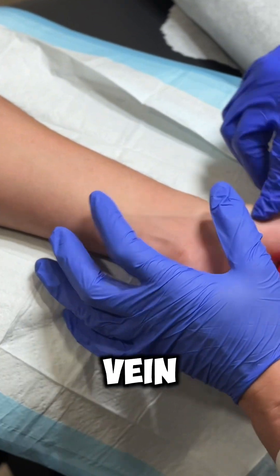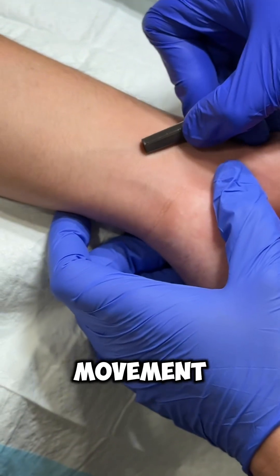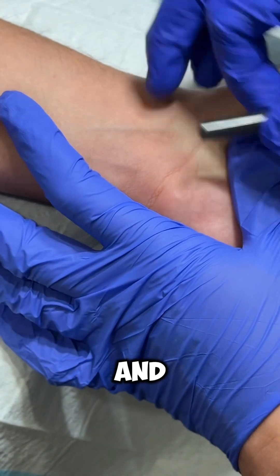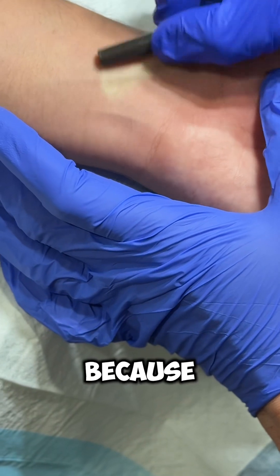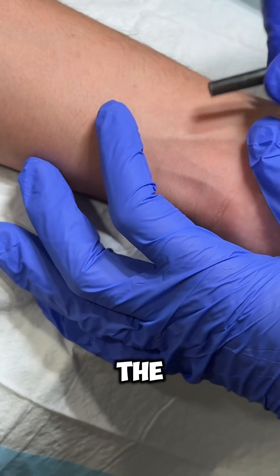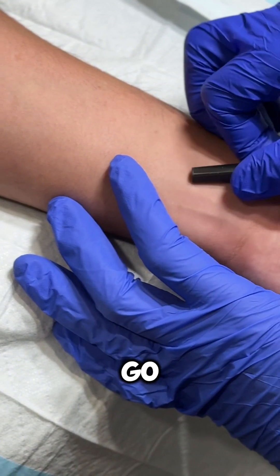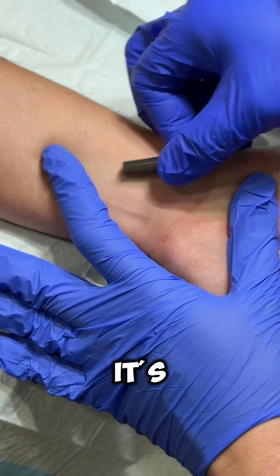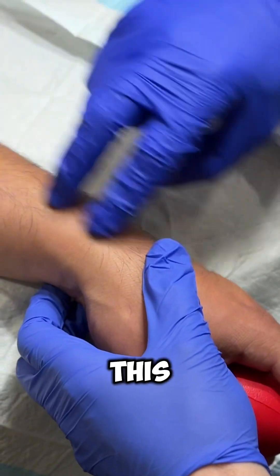This is a beautiful vein right here. The problem is, if you just go straight at it — see how it moves? It's moving around, up and down. What I do is stretch it this way and see — it's still moving but not moving sideways anymore. A lot of mistakes happen because people go in and the vein moves to the side. You either perforate through the vein or it gets out of the way and you end up right next to it — that's why you get no blood.